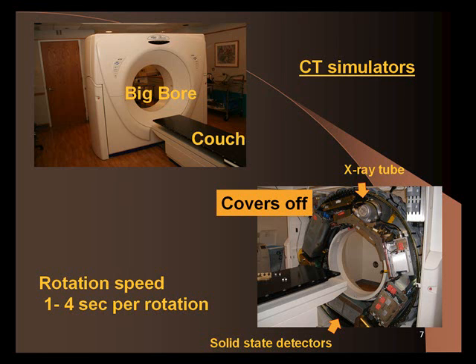And that might be okay for diagnostic purposes because nothing's going on out here, like for prostate cancer. So the radiologists are okay with just seeing the inside of the patient with the prostate. Now, that's not okay for radiation therapy planning. When we're planning, we're going to be calculating our isodoses based on beams that come in from different directions.